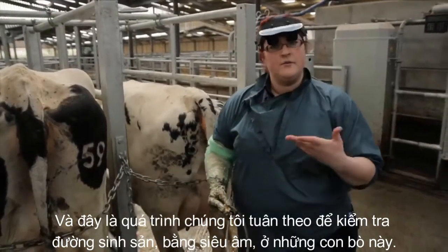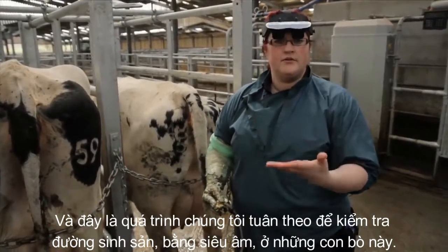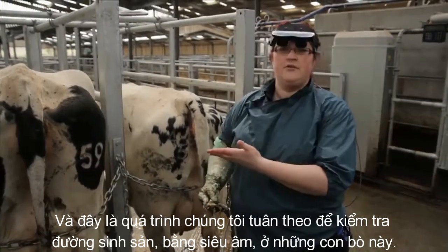And this is the process that we follow to examine the reproductive tract using ultrasound in these cows.